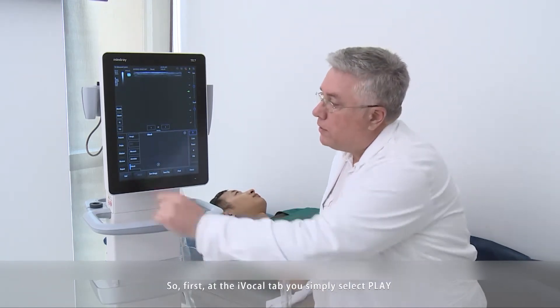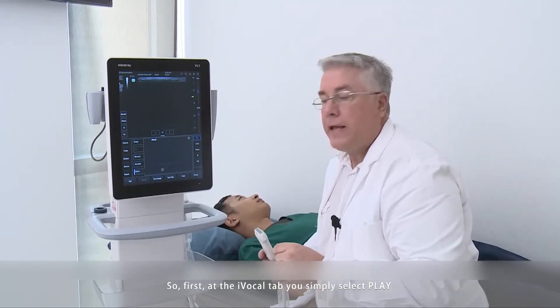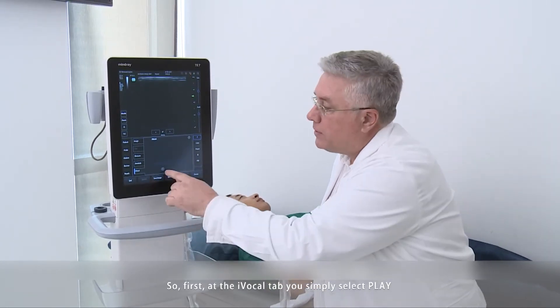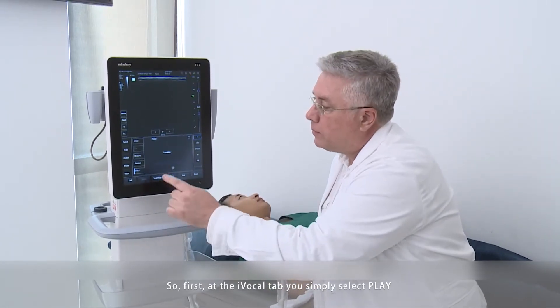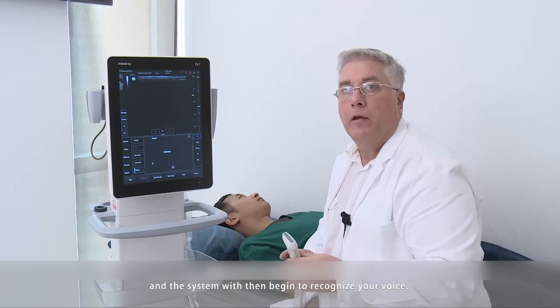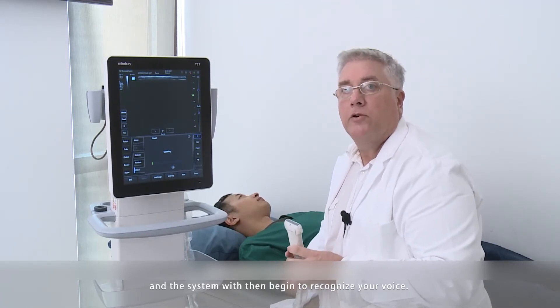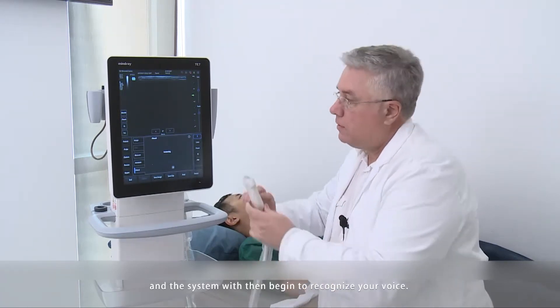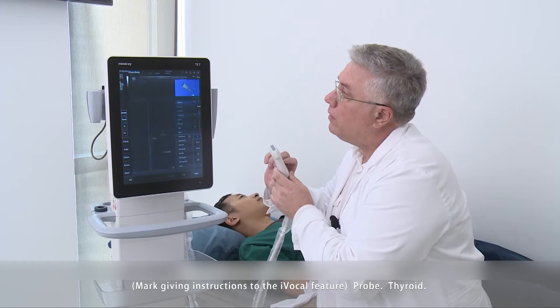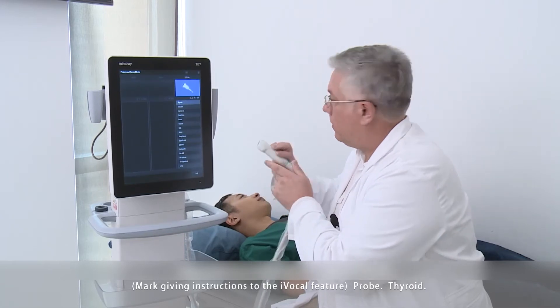At the iVocal tab, you simply select play and the system will then begin to recognize your voice. For example, saying 'Probe' and 'Thyroid' will prompt the system to respond accordingly.